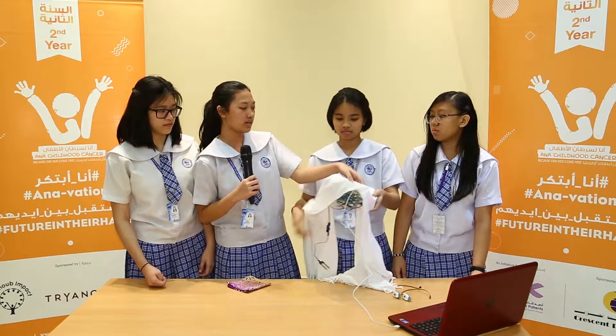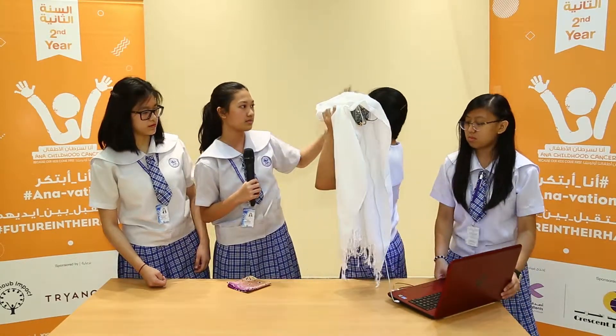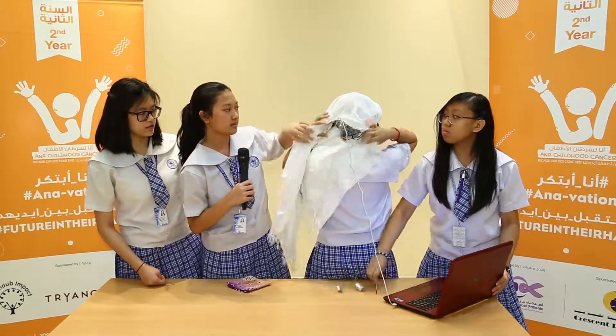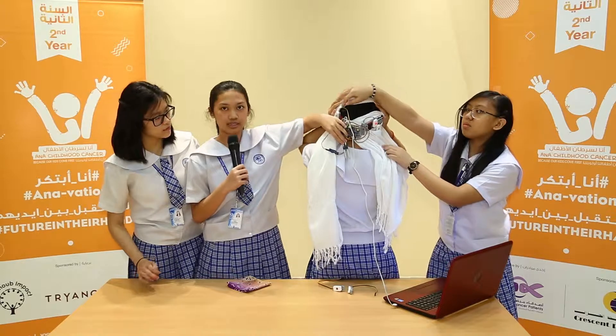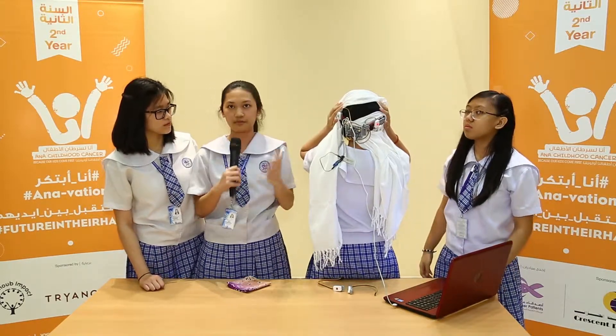So this is how it will look like when we try it on. We'll put this at the back, up here, and so it will detect the humidity sensor. We also built the manual and adjusted it to make it comfortable for kids to wear.